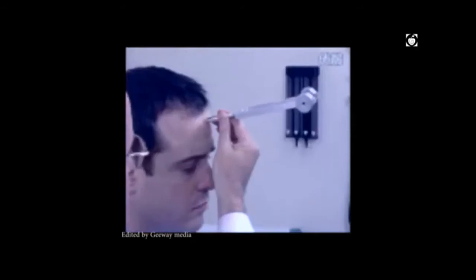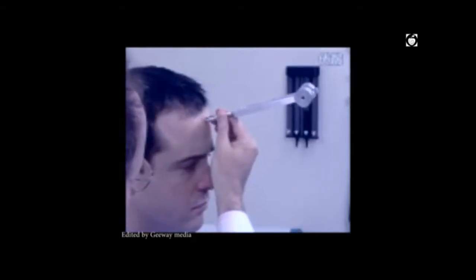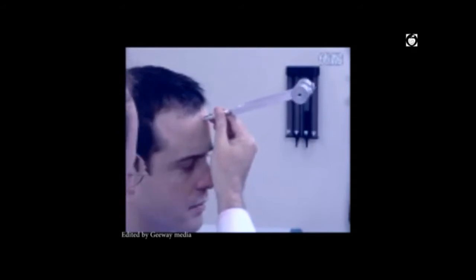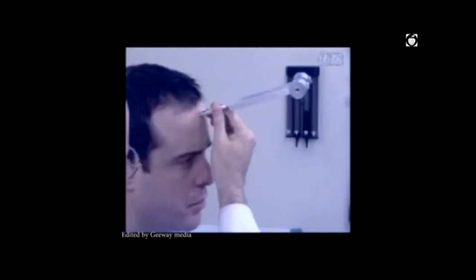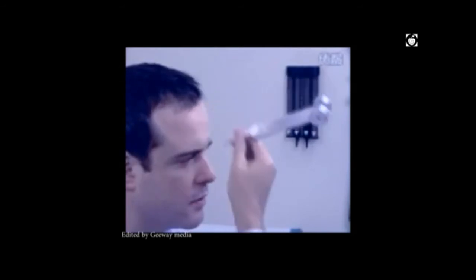For the Weber test, strike the tuning fork and place it midline on the patient's forehead. Ask whether they hear or feel anything and where. If the patient hears it equally on both sides — referred to as no lateralization — that is a normal Weber test.